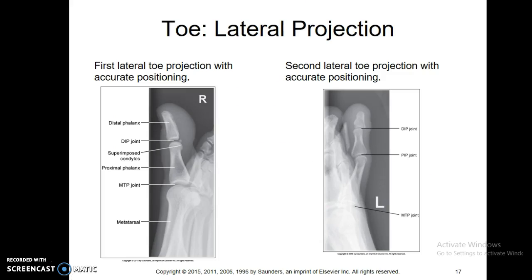Laterals are really up to the technologist's skill. Some techs are really good at it, some techs are not good at it, but what you want to do is be your patient advocate and manipulate the foot as much as you can to try to open up those spaces, because maybe there's one little tiny fracture that will only show up on the lateral. So this is really up to how much the tech really wants to get a good lateral image.